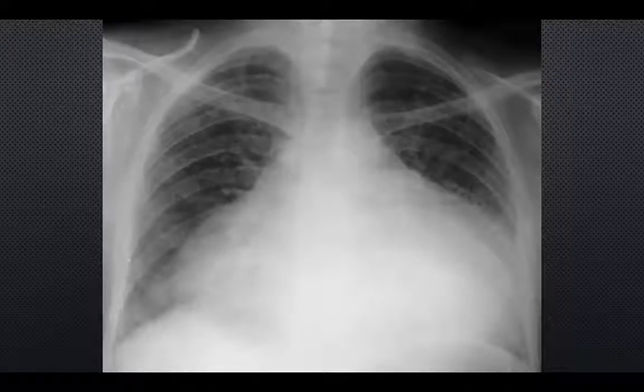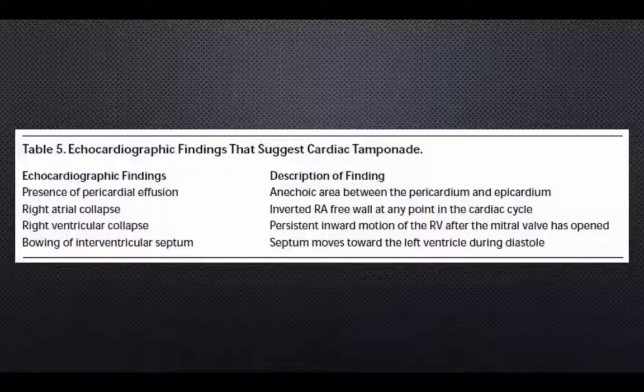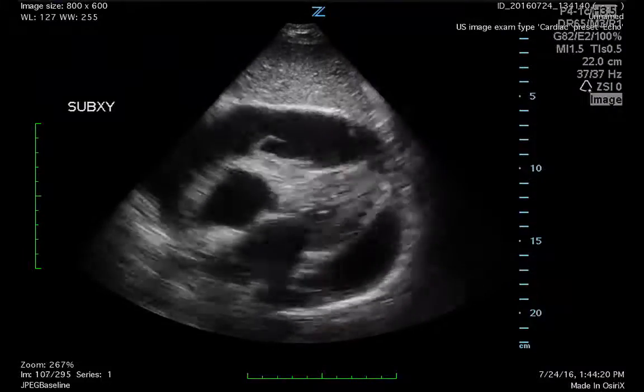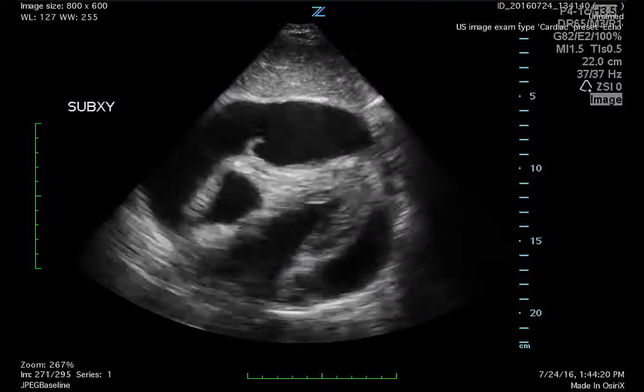significant cardiomegaly concerning for pericardial effusion, which in the setting of hypotension suggests tamponade. With tamponade, ultrasound findings include rapidly accumulating small pericardial effusion or a large effusion, early diastolic RV collapse, late diastolic atrial collapse, exaggerated tricuspid and decreased mitral diastolic inflow on inspiration, and dilated IVC with no variation with respiration. Here is the patient's ultrasound. The ultrasound shows a large pericardial effusion with complete collapse of the right ventricle in diastole.